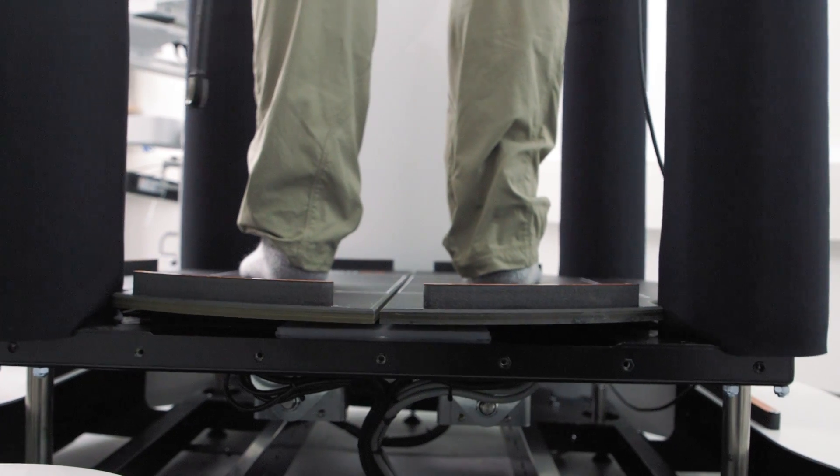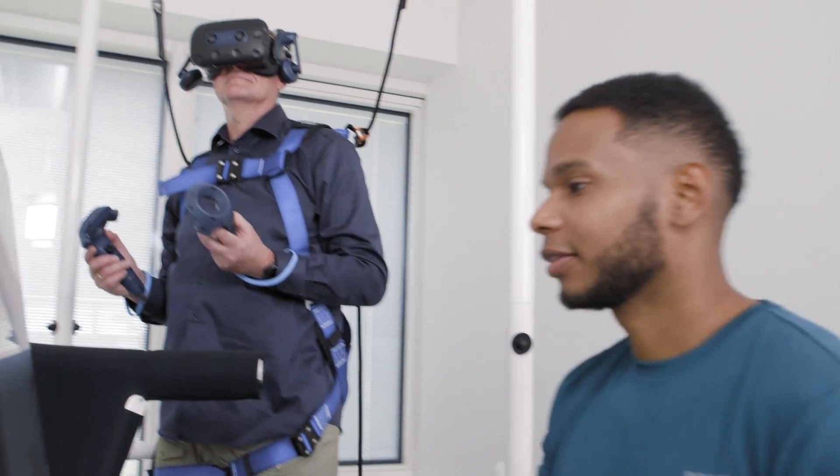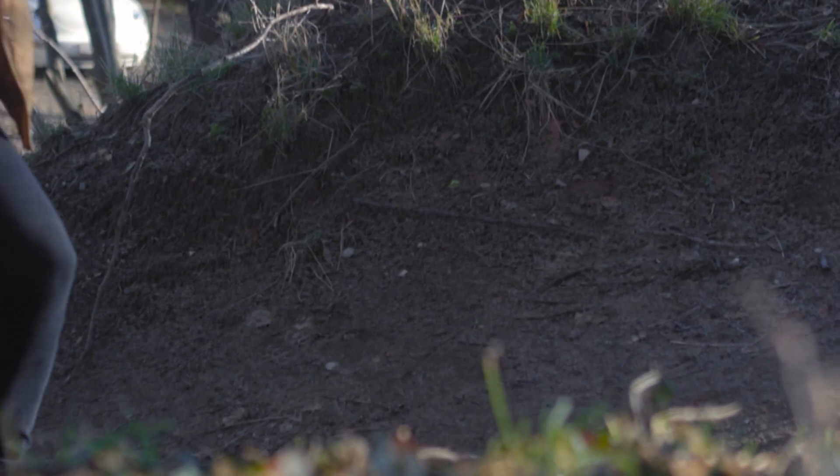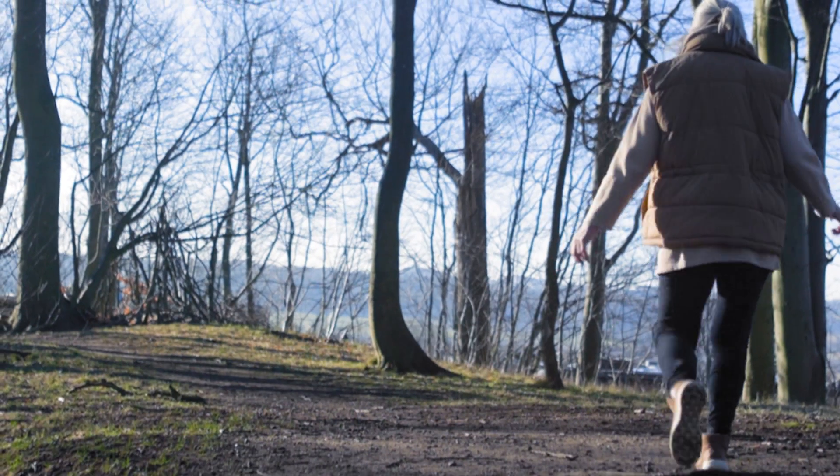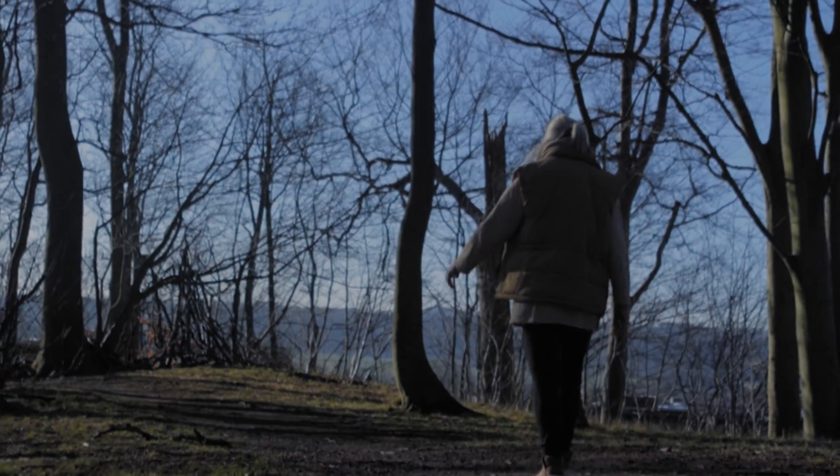The Virtualis Immersive VR solutions let you help your patients regain their balance and their quality of life. We say it is balance progression made motivating.